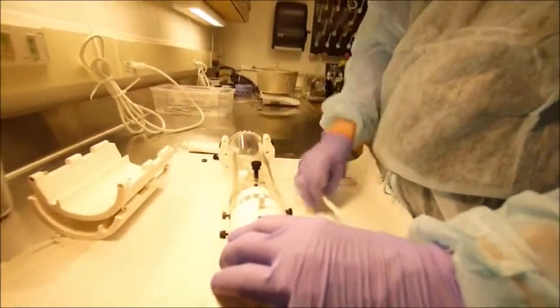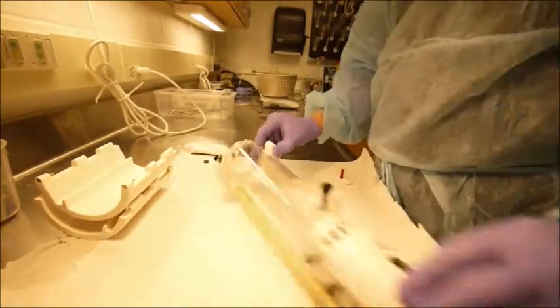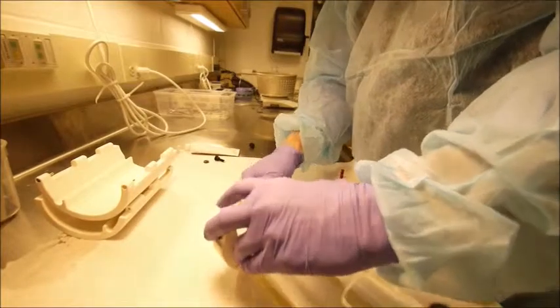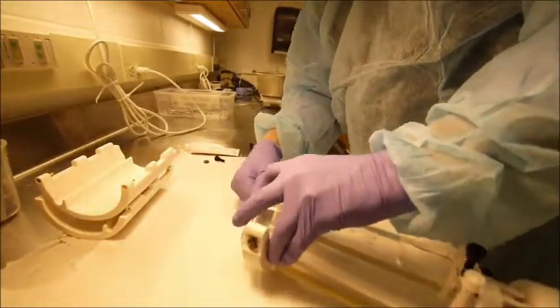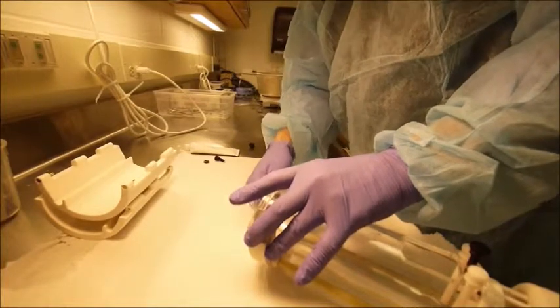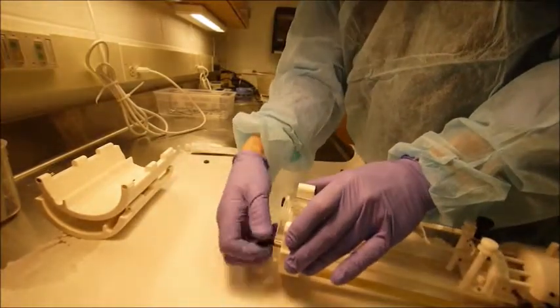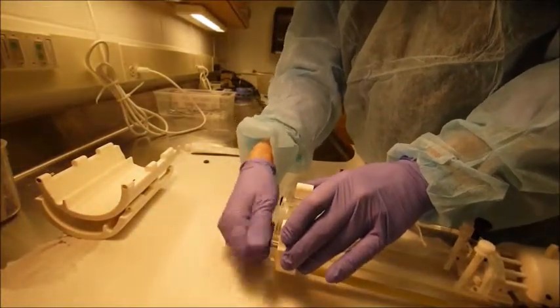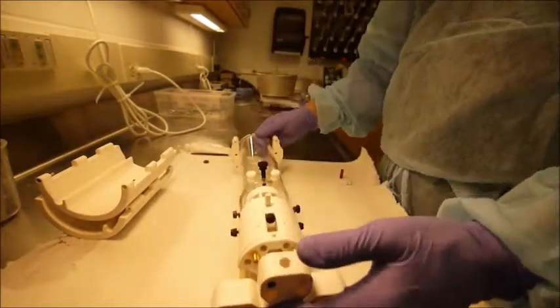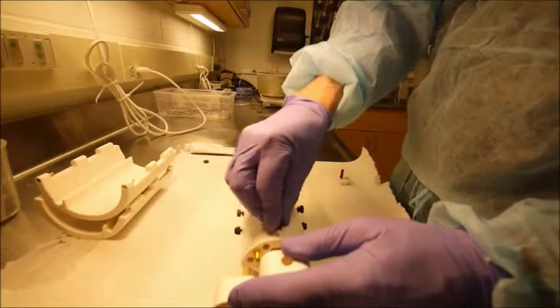The black screw between the shoulder bars is used to adjust the depth of the shoulder plate. The body tube is locked into the back end of the chassis with two screws. The coil is locked into the front of the chassis with a single screw.